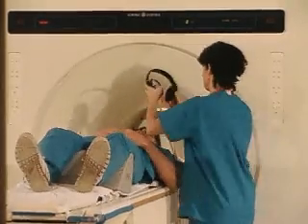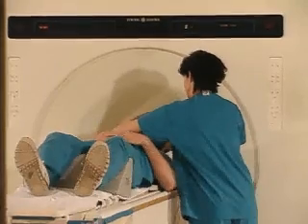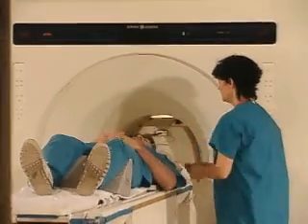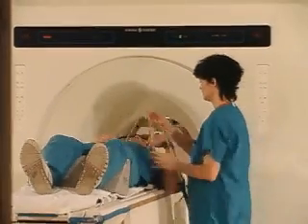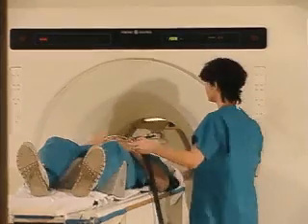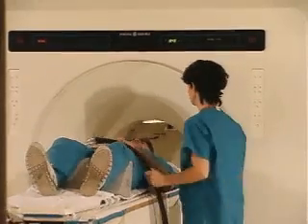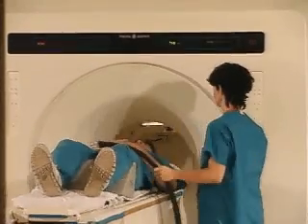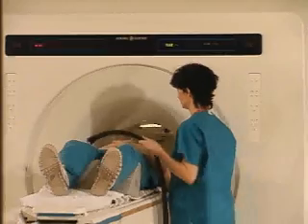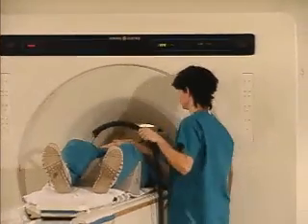Nuclear Magnetic Resonance Imaging, or MRI, is a popular diagnostic technique because it does not submit the body to dangerous high-energy particles. MRI is performed by placing the person in a large cylinder that contains a strong magnet.